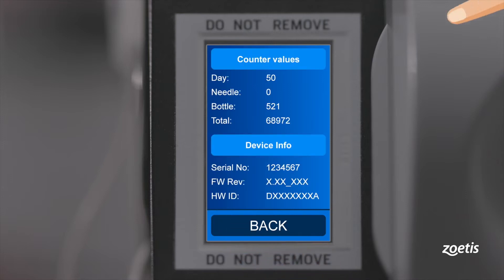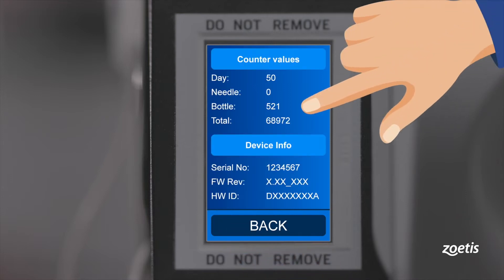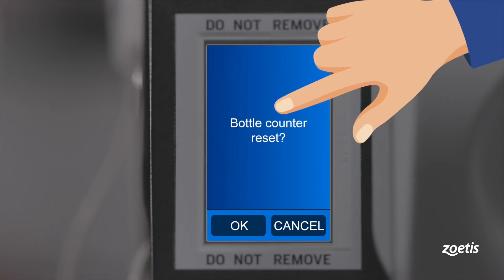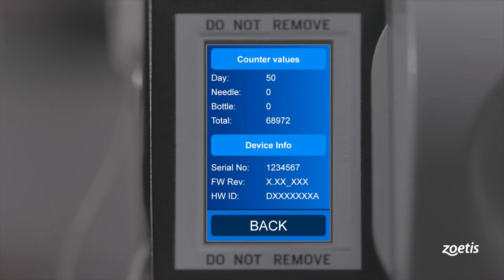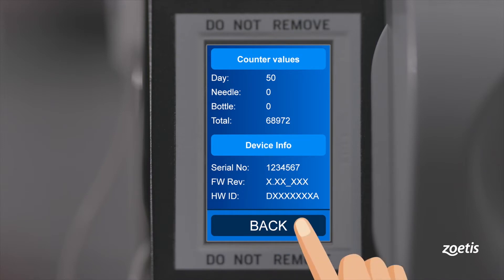The bottle counter indicates the shots per bottle used. By touching it, you can reset the counter. Hit back to get to the main screen again.